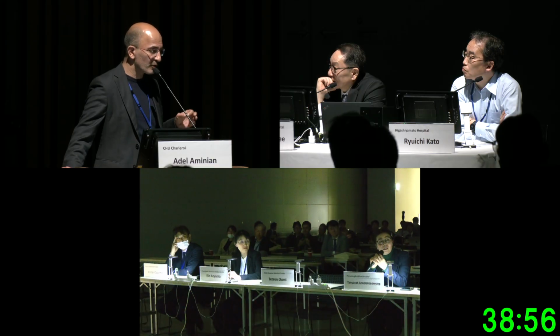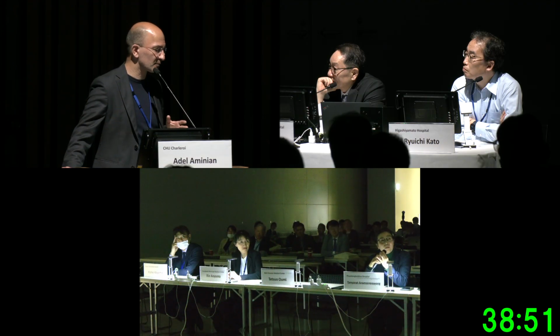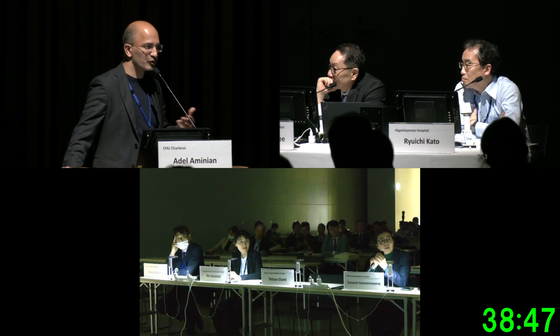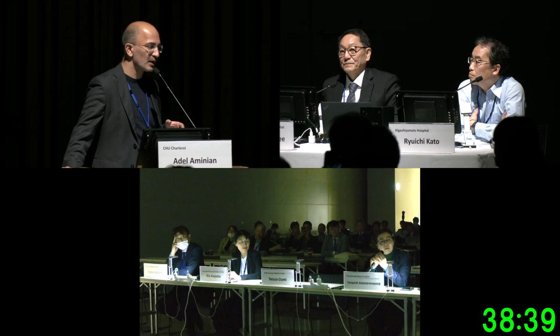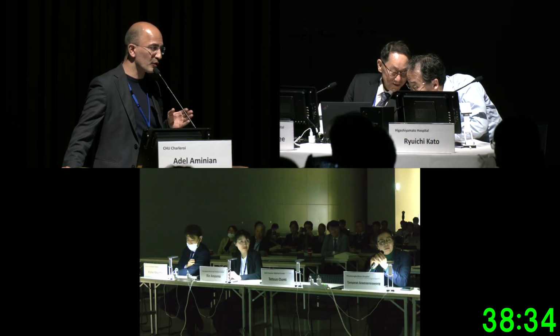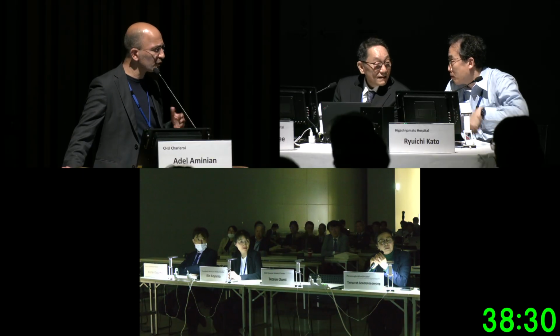I cannot puncture a femoral artery without ultrasound. It's almost mandatory because you do less and less femoral. I do structural like many people here. But even for a coronary procedure, even if I have to put in a 5 French or 6 French, I use ultrasound guidance, because even a 6 French puncture too high or too low can create very devastating complications, not only for structural.